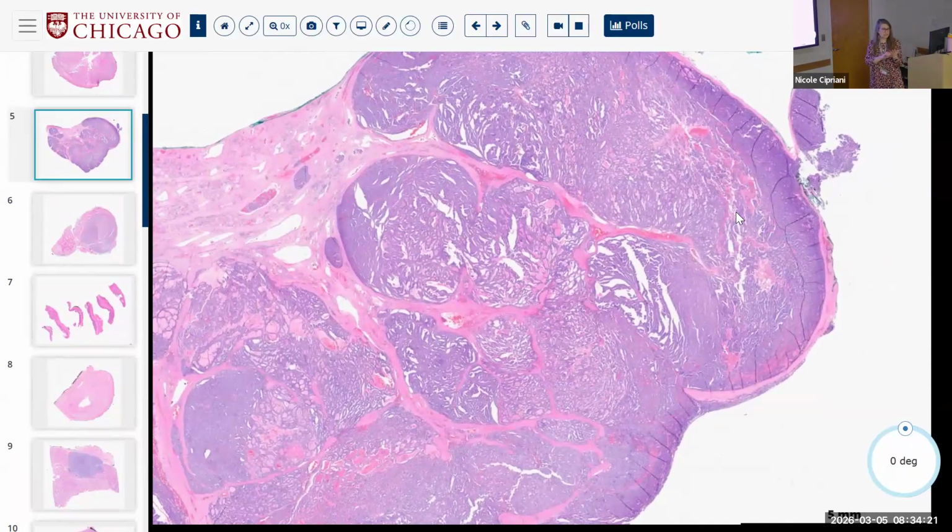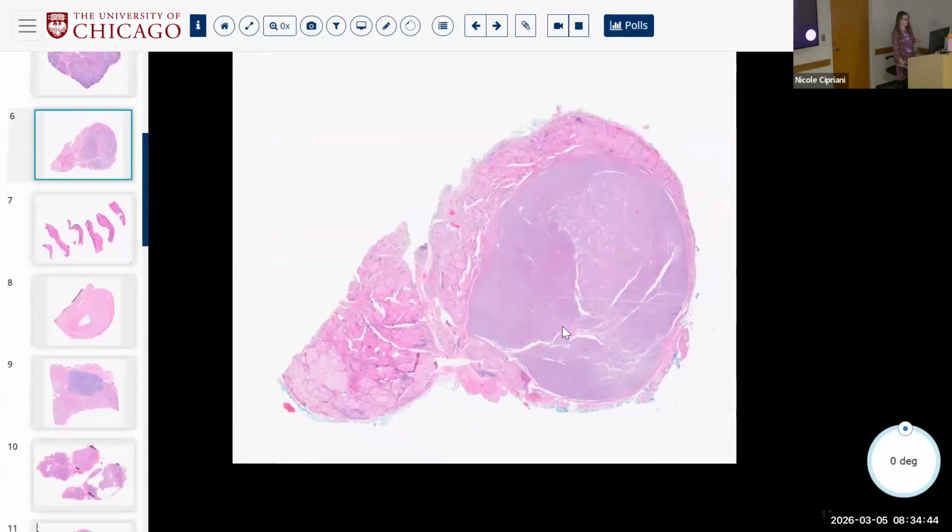But it's basically like, is it a PTC high grade? Is it an FTC high grade? Or is it an OTC high grade? So I will use those three terms. I won't just say high grade follicular cell derived non-anaplastic because if it's PTC, it's going to be different than an FTC or an OTC, right? So I will just say FTC high grade. So that's what we would have done in this case. Okay, all right, next.